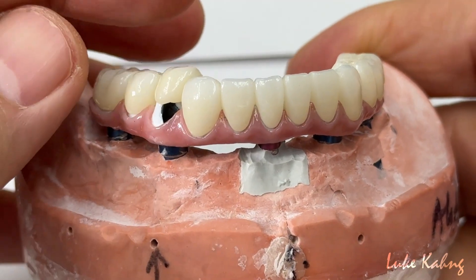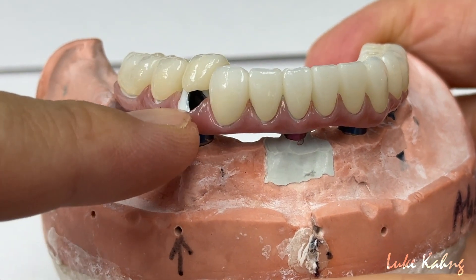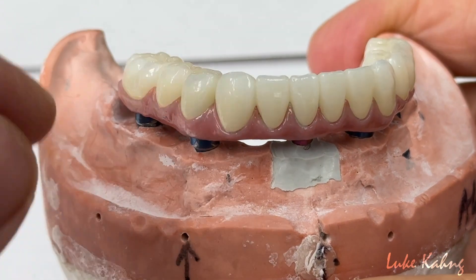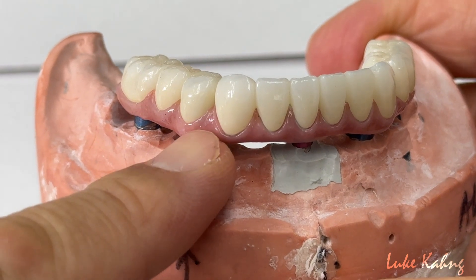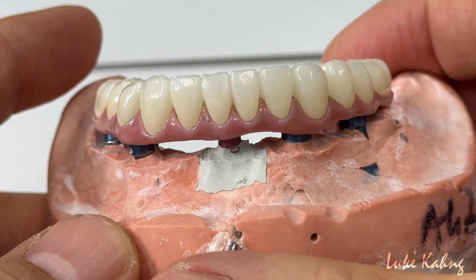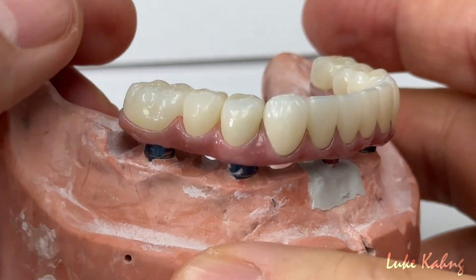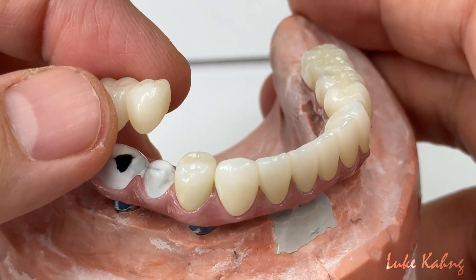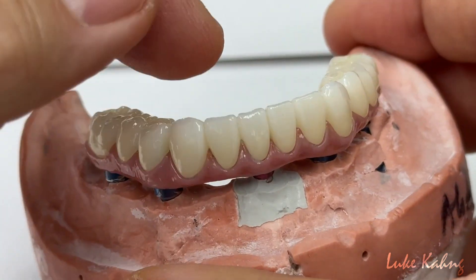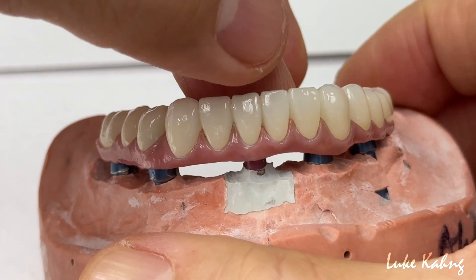After finishing the work, the doctor will put it back to the patient's mouth, and then this is temporary cement on the top of this, so we cover it just like that. It's very imperative — not only this — this is the highest aesthetic as much as possible. And also we give them the maximum strength between the two units here, and the other one is single. Six unit bridge, top and bottom like this.